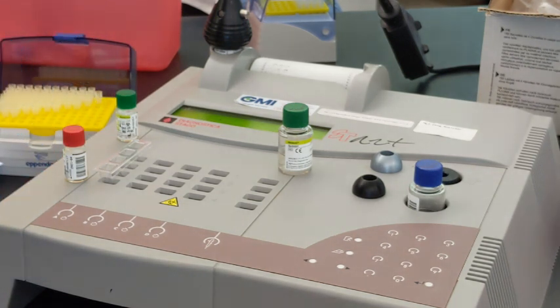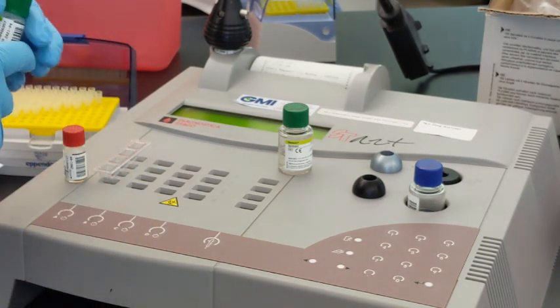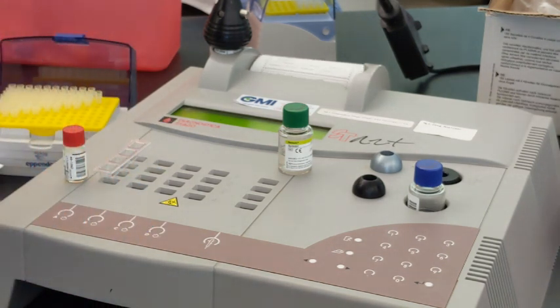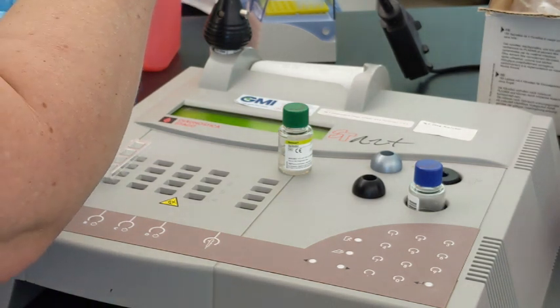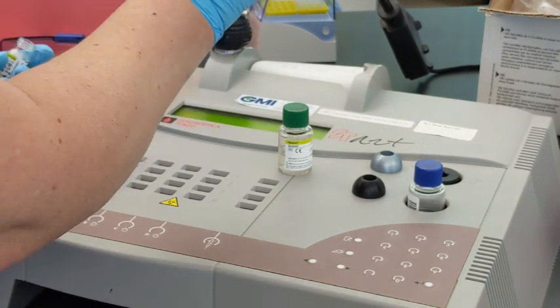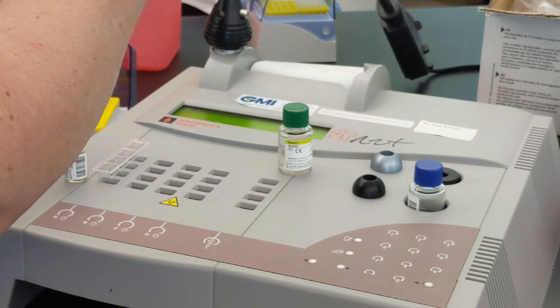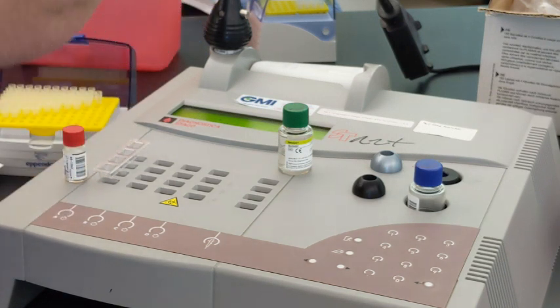So the first thing we're going to do is we're going to add our actual sample, either a QC sample or patient sample. And remember, you should be handling your QC just like your patients. So I'm adding 50 microliters of 6957 into spot 1 and also in spot 2.